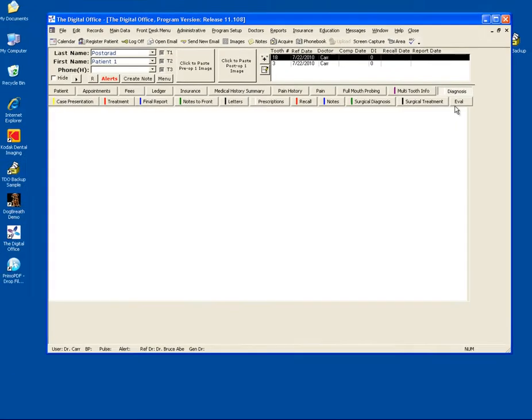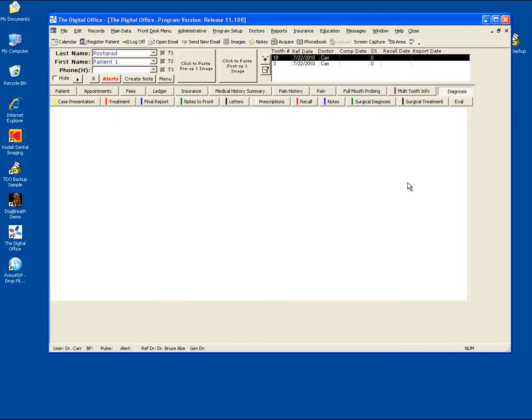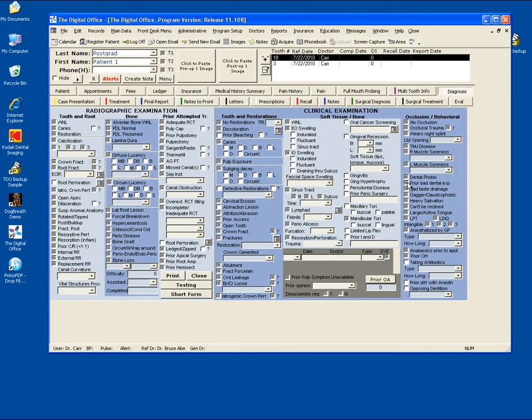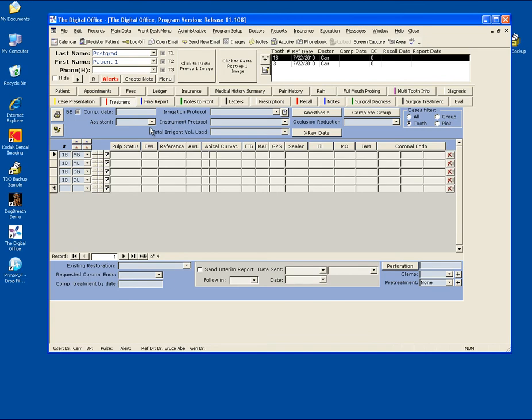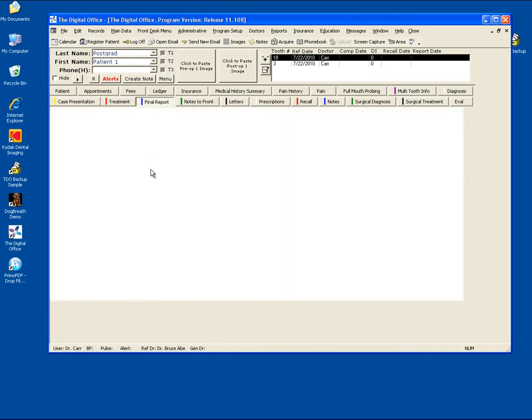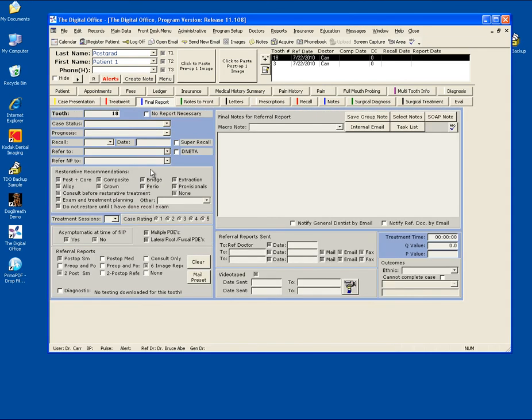Diagnosis tab, this is your standard diagnosis page. If you wish to fill this out, simply click off the items that apply to this tooth. Treatment page, and your final report page.